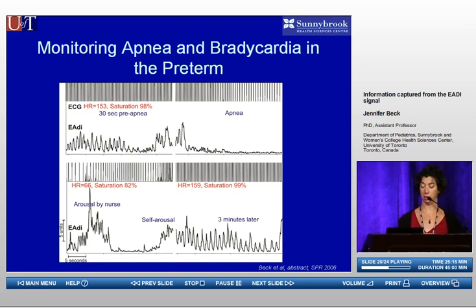This is the last example I'm going to show you, and it tells you about the diaphragm electrical activity in a preterm baby who had a bradycardic spell. So I'm sitting at the bedside and I'm monitoring for hours and hours, and I'm looking at the diaphragm activity. On the top panels, I wrote ECG, because we have the ECG signal on our catheter, so we can plot it as well. So each black bar is a heartbeat.